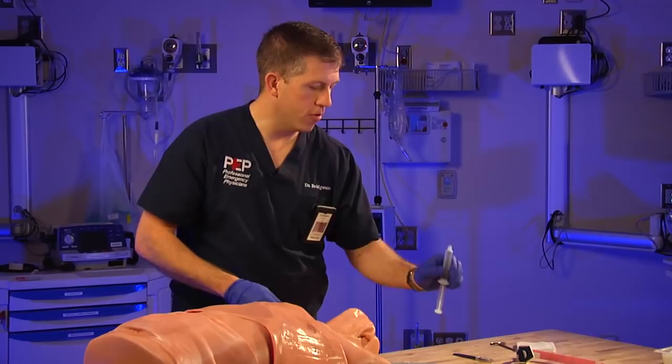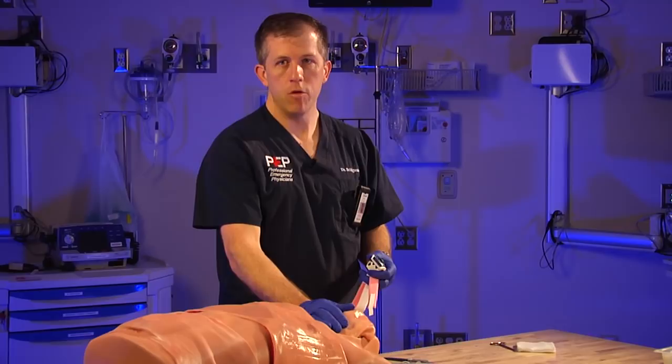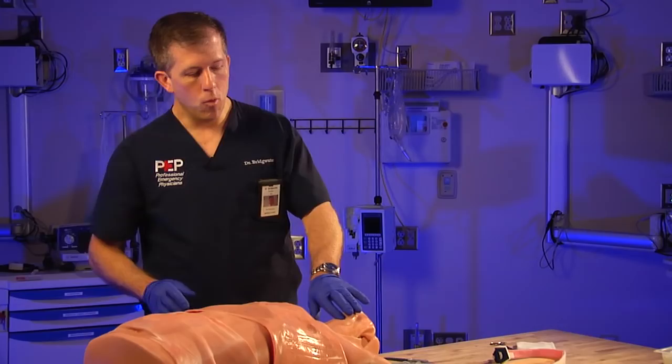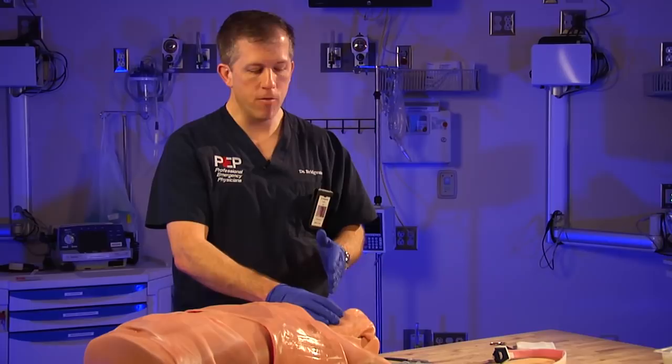You'll want some type of securing device — commercially available options, a trach tie, or tape will work. Once you perform this procedure, always have a hand on the airway; whoever is ventilating the patient needs to maintain control so you do not lose this airway. When preparing, identify the landmarks early — any time you think you may be proceeding to a cricothyroidotomy, not when you actually need that airway. Hopefully you've already identified these landmarks in the difficult airway patient.